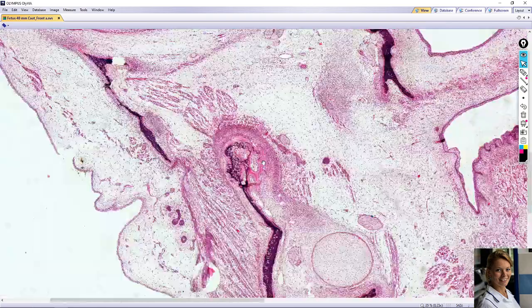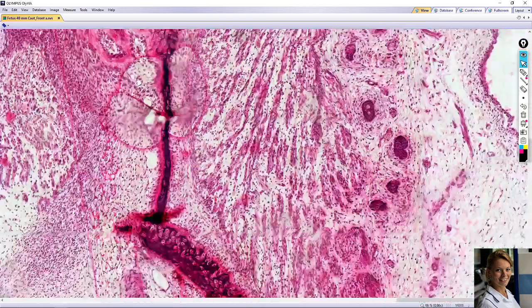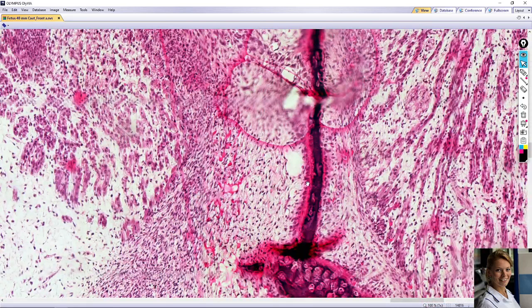So this is one side, and on another side you can see also osteoblasts, which cover the bone trabecula. Beneath the osteoblasts is osteoid, very rich pink. The osteoid is unmineralized bone tissue, and the darker purple is mineralized bone tissue. Osteocytes are trapped in bone matrix.